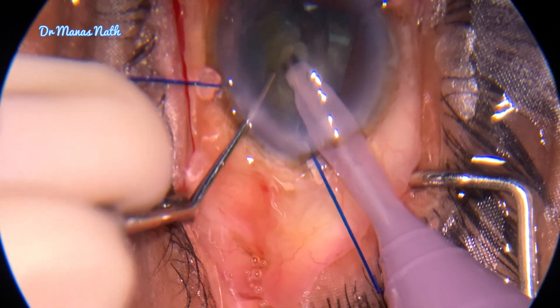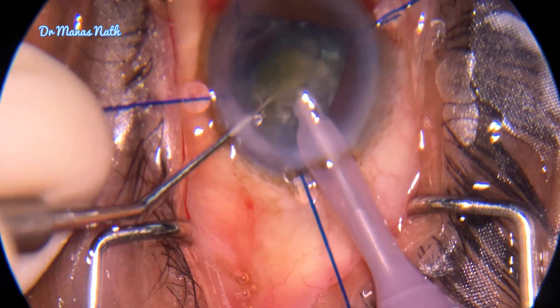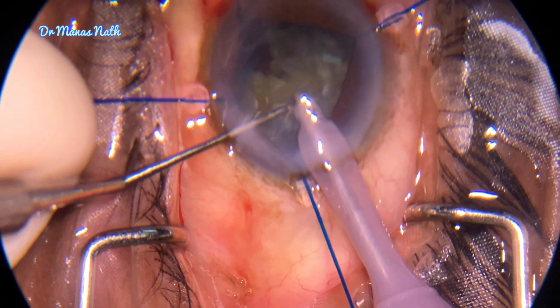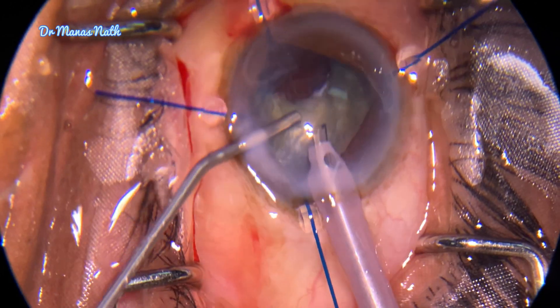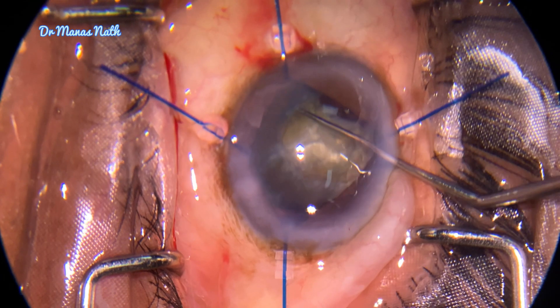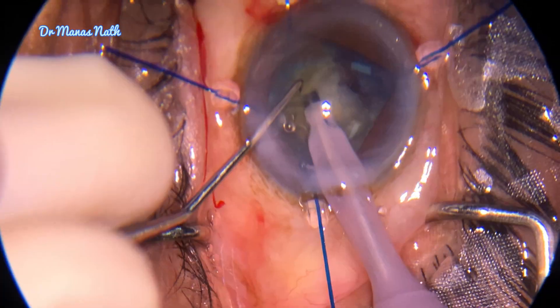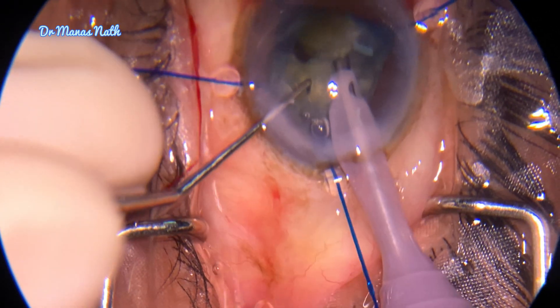Now we can see that the nuclear piece which was not coming towards the phaco probe before came easily towards it, and I could do the chopping easily and emulsify. Still the nucleus was not rotating, so I came out, stopped phaco in between, rotated the nucleus gently, and then continued with phacoemulsification.